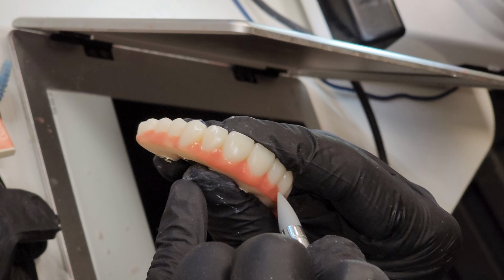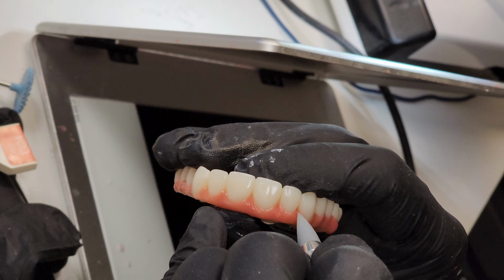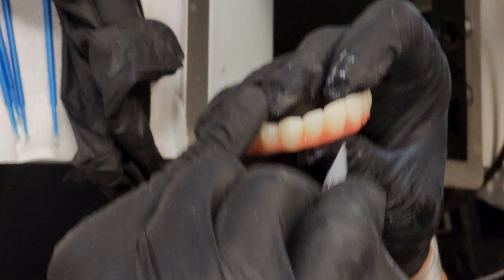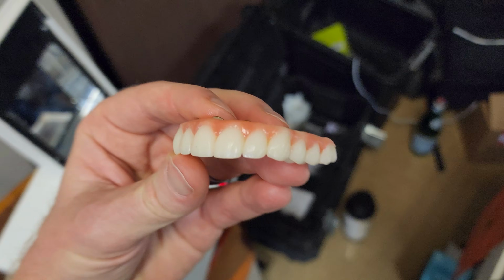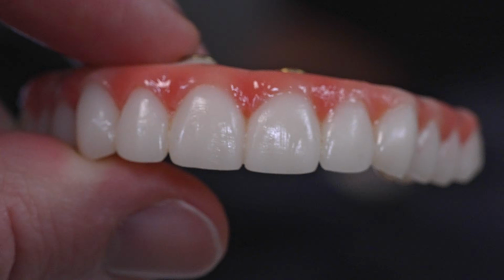And then finally, with this prosthesis, we add color to the gums. We tried to add a little color variation in the gums that you would see with natural gums so that this looks lifelike. Now, with all that finalizing, back to the mouth. This is what everything looks like right before we put the temporary teeth into place. The gums are really raw and inflamed.